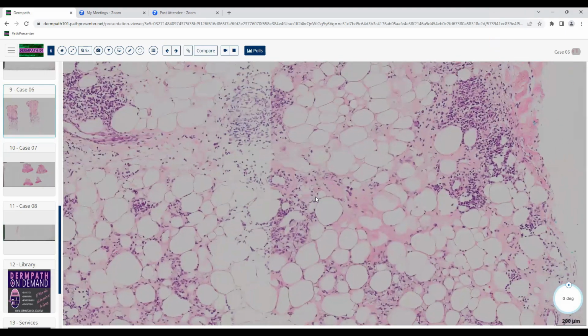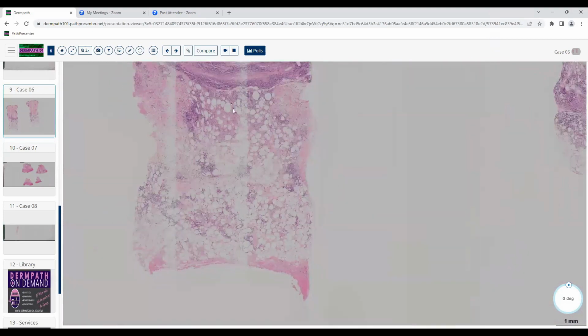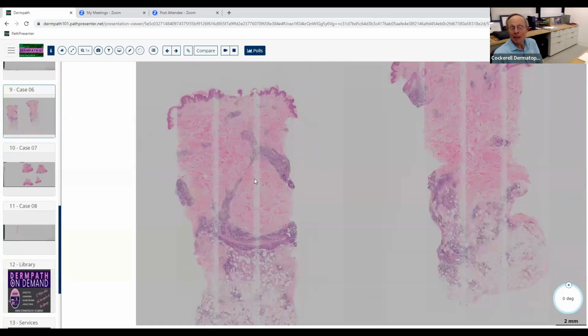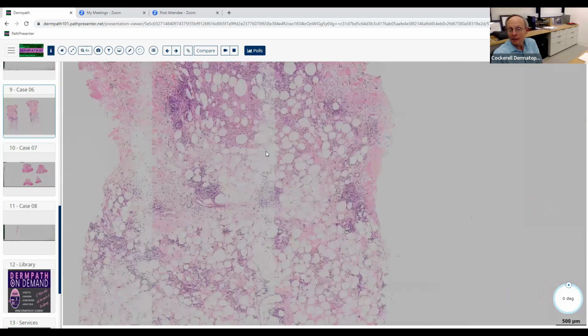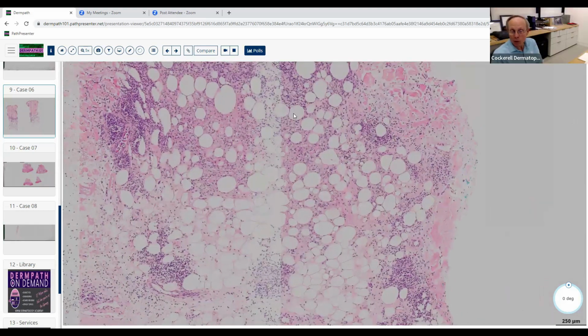Can it be erythema chronicum migrans? No. Okay, but that's one of the lymphocytic infiltrates that we think about. I can help out with the 5 L's, Dr. Cockerell. Yeah, spit them out for us real quick. It's lupus erythematosus. Yes. So what's the diagnosis here, by the way? I think it's lupus panniculitis. Yes, lupus profundus. You're right.